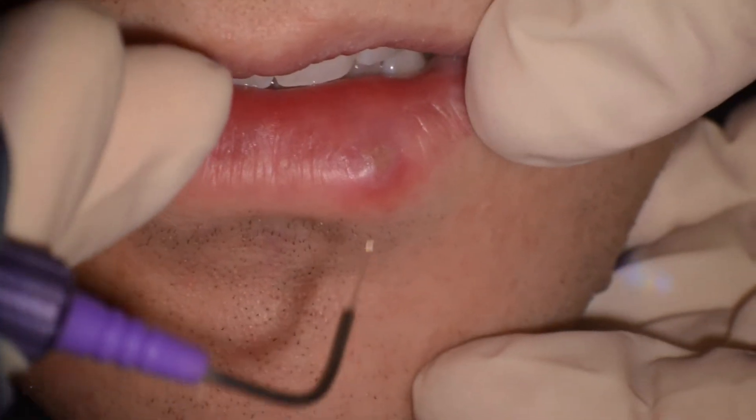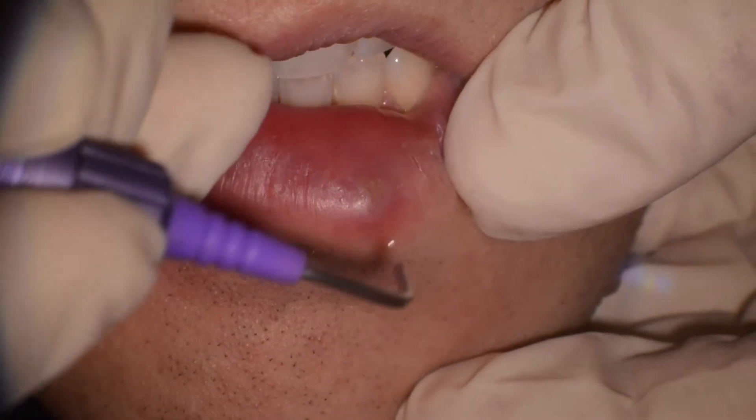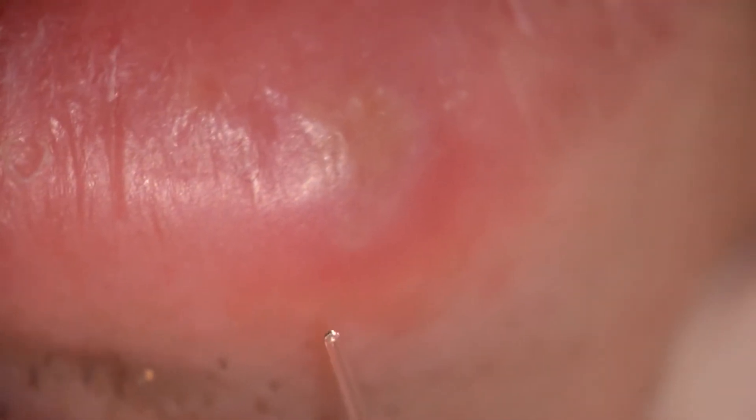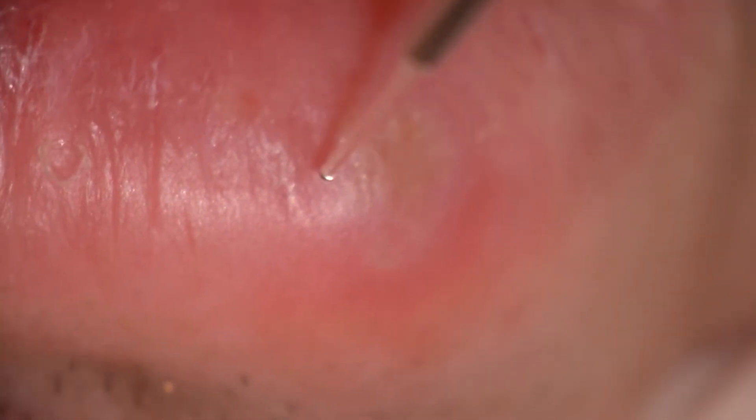This is 0.6 watts — if you feel something, just put your hand up. This cycle is 0.6 watts for 45 seconds. Four more seconds. That's followed by 0.7 watts for 45 seconds and 0.8 watts for 45 seconds.